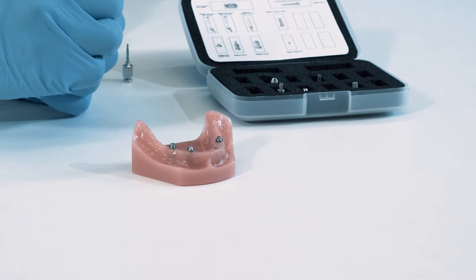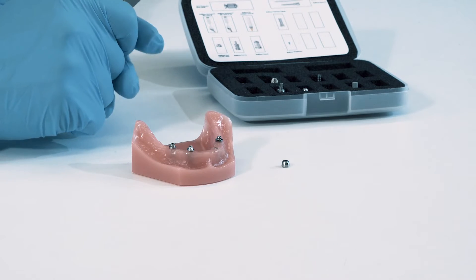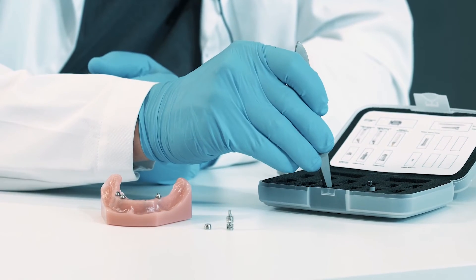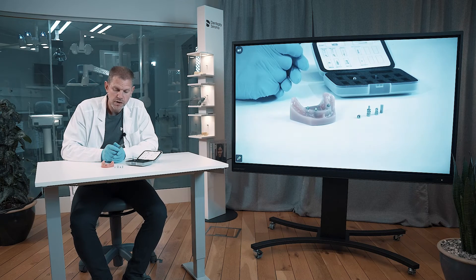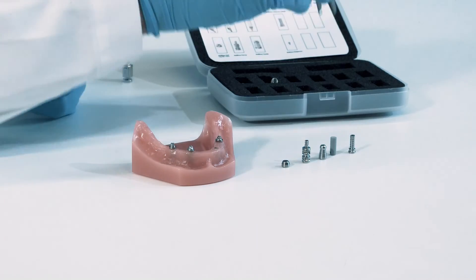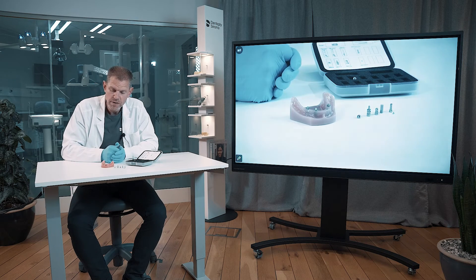Abutments are in the model and then you have many possibilities to try whatever component you like. For example, the healing cap placed right after abutment installation to protect the abutment during the healing. We have a range of different impression components: the pickup, the transfer, and the Ioflow-S. The first two are for conventional impression taking, while the last one, the Ioflow-S, is for digital impression taking scanning. And finally, we also have this temporary titanium cylinder that goes together with this bridge screw in blue. That is the options you have and how they fit onto these multi-base abutments.